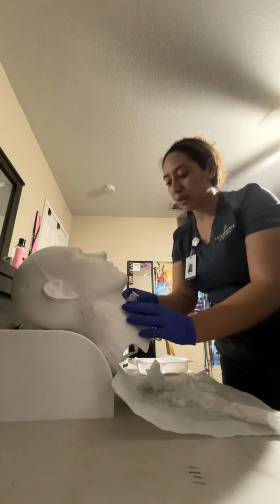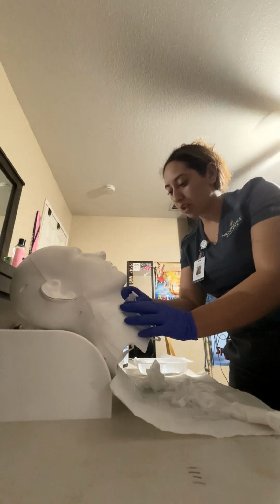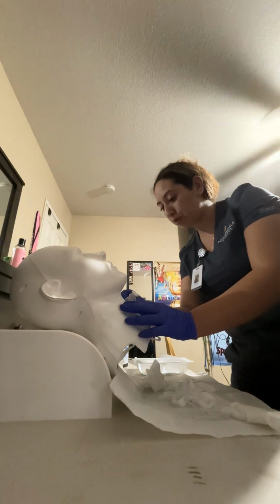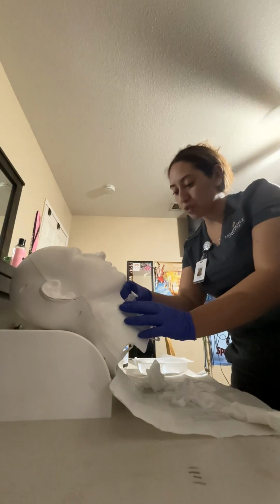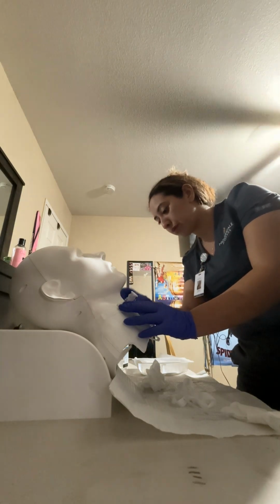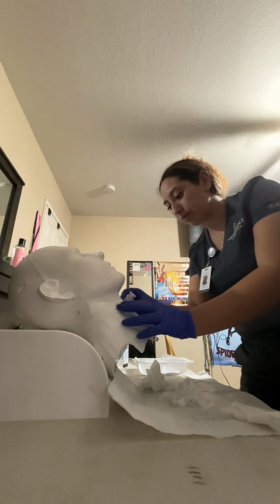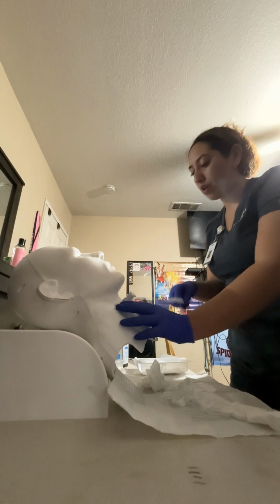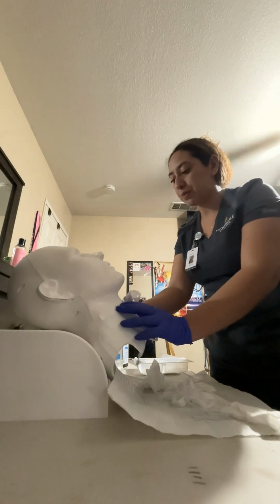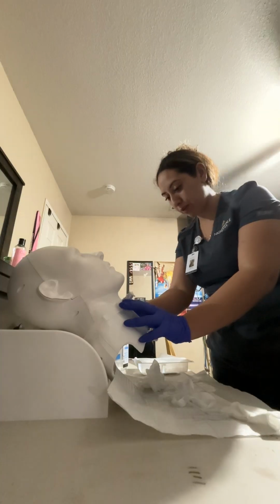Okay, so at this time, I am going to lightly remove his trach ties by untying it. Okay. For this part, I will ask my patient if it's okay if he can lift his head for me.